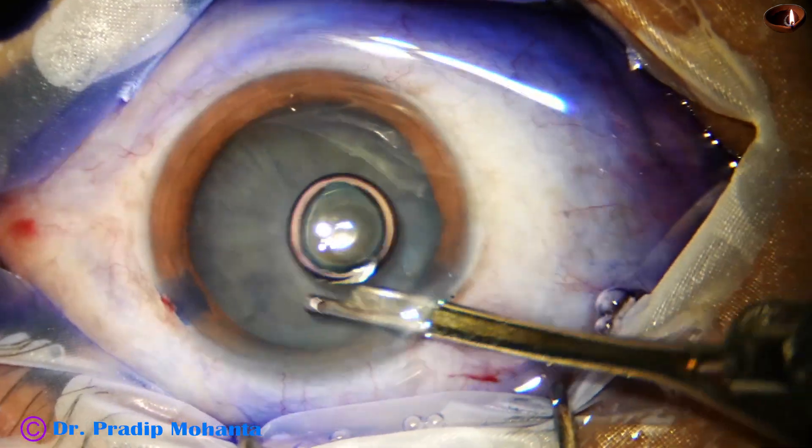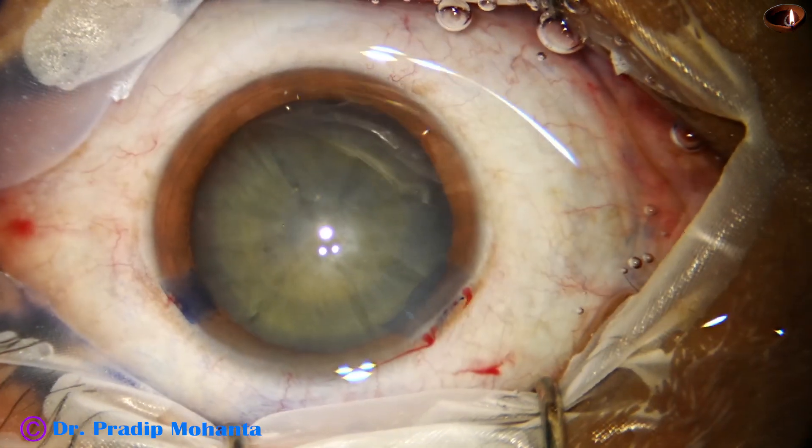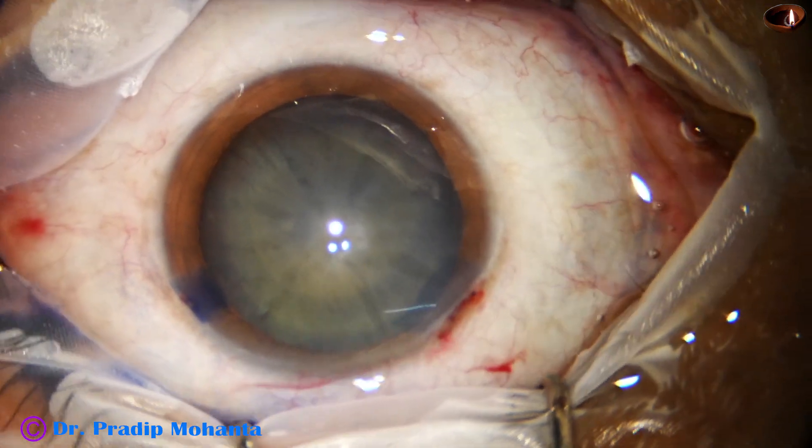So initially the side port should be small, and later, if necessary during cortical aspiration, it can be enlarged.